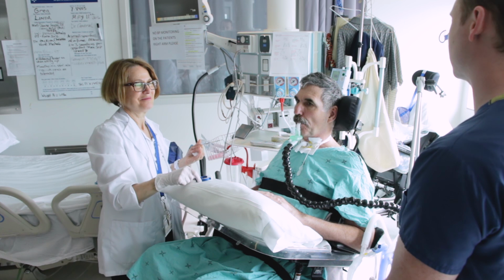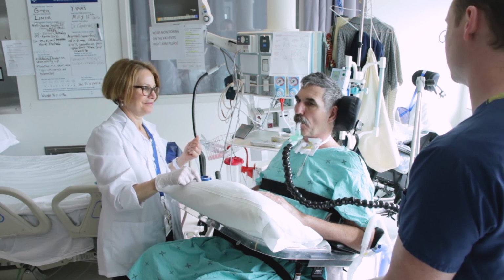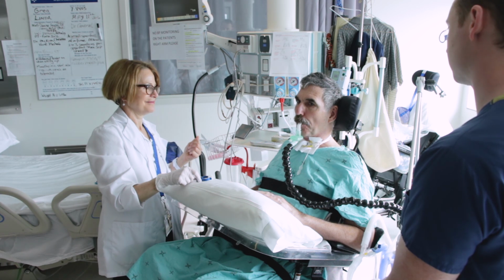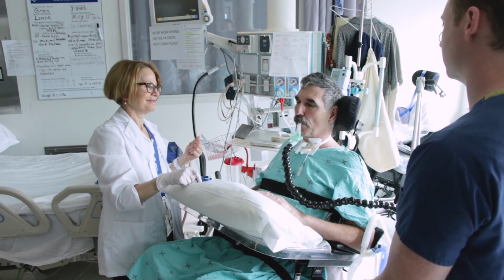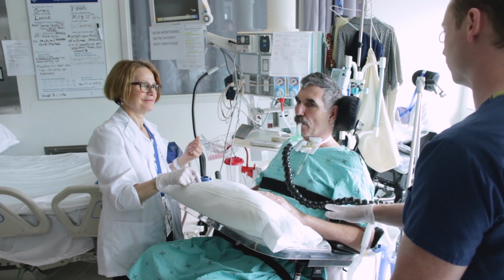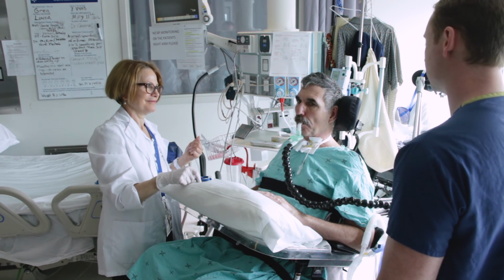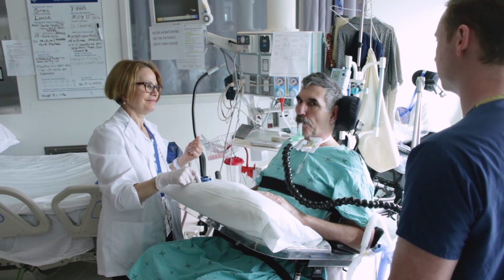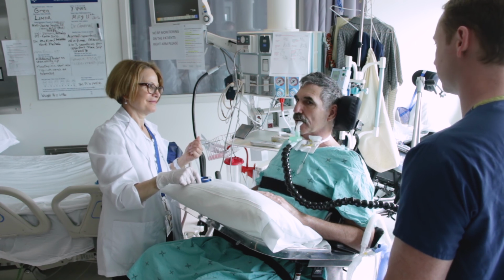So Greg, I'll leave notes for staff of our new settings for mouthpiece ventilation. You're comfortable with that? Yeah, that works for me. And that we'll be doing breath stacking with and without the nose clips. It's good that you remind them too that you want to try some with and without, but I'll definitely write that in your book, in our RT little book, that these are the new things that we're going to be trying. That works for me. Yeah, I can do that.